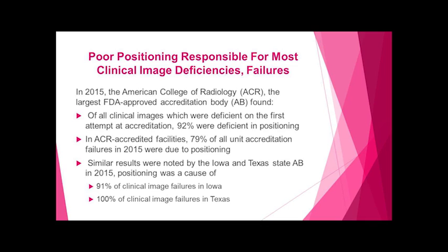So the positioning problems are significant, and we know that they're there. In ACR accredited facilities, 79% of all unit accreditation failures in 2015 were due to positioning. I think you get it. We see in Texas, 100% of their clinical image failures had to do with positioning.